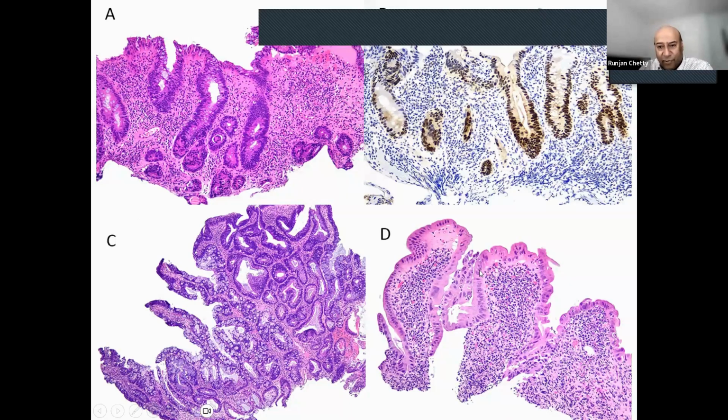It's not as hyperchromatic looking, but you'll see that there's stratification and hyperchromasia, as well as pleomorphism within the nuclei. There's a smattering of acute inflammatory cells here as well, and you can see that in this bottom fragment. But clearly, the nuclear changes outstrip the amount of inflammation here. And despite there being subepithelial inflammation, I feel quite confident to say that there's dysplasia here, irrespective of the fact there's a degree of acute colitis superimposed on it.